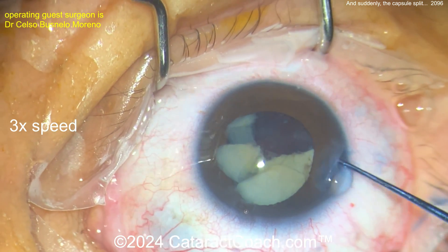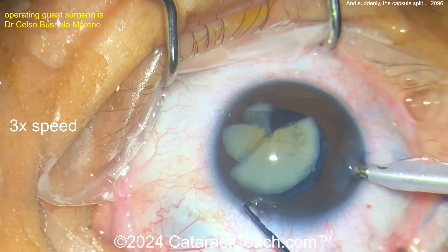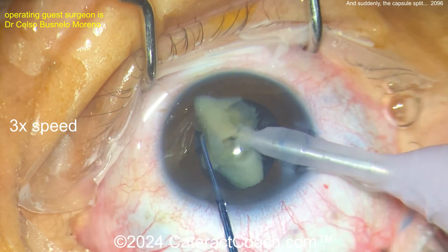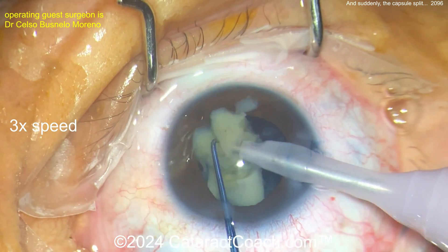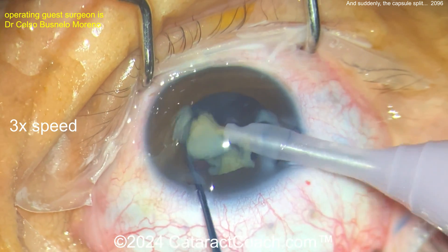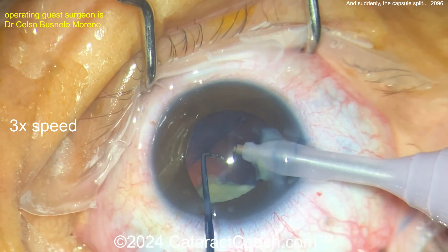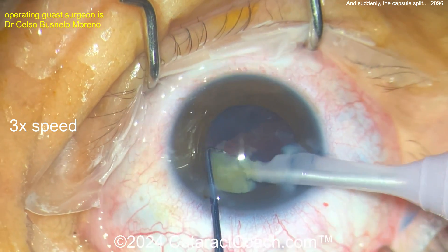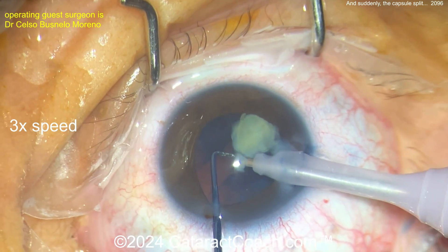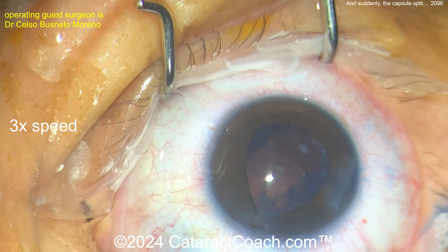More viscoelastic is probably a good idea, especially behind it. The posterior capsule appears to be intact, fortunately. Using the chopper again to get that piece up — I like the viscoelastic, as we say: it's cheaper than vitreous. Now that the posterior capsule is probably intact, just emulsifying these pieces — they come out pretty easily. You also want to keep an eye on the fluidics: are the pieces flowing into the tip appropriately? If they're not flowing in, you may have vitreous. Listen to the machine — if it goes ding ding ding of occlusion but you don't see a piece of nucleus at the tip, that's probably vitreous.